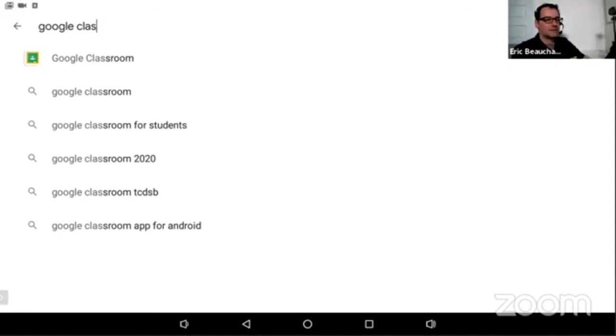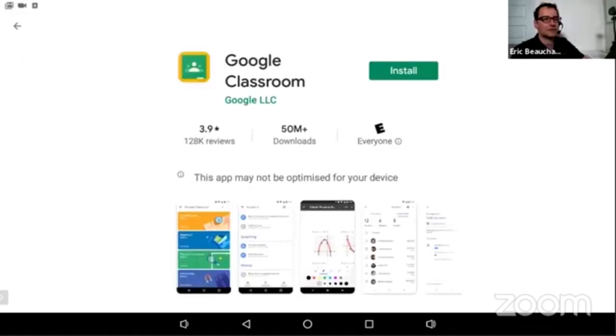So Google Classroom, I type Google Class, and the first thing that comes up, Google Classroom, tap on that, and you have the option of installing it. So this is how I would start by addressing that question.